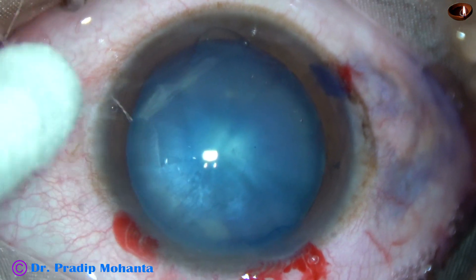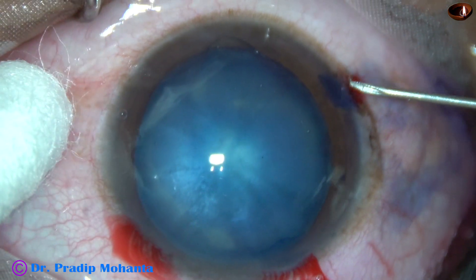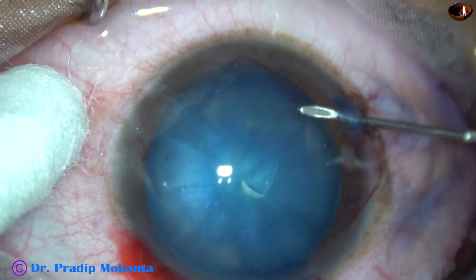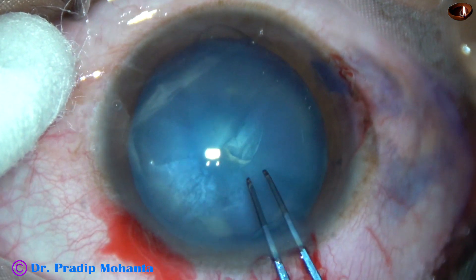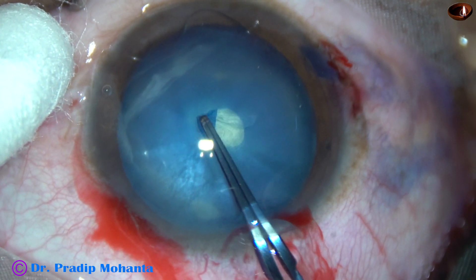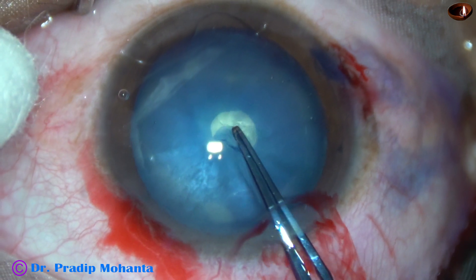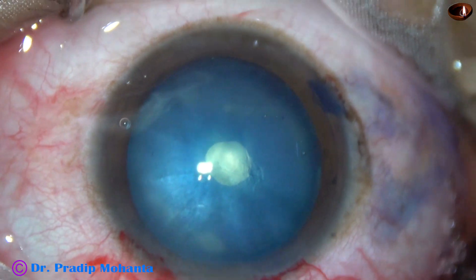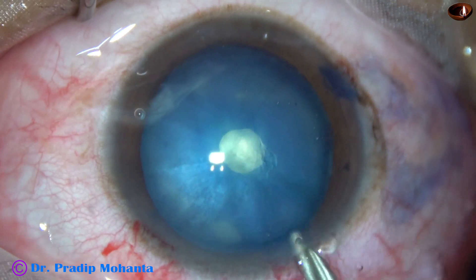And now my plan is to do a two-staged rhexis. This is a 26-gauge bent needle. A C-flap is raised in this way. And the C-flap is converted into a small rhexis. We can call this a mini-rhexis. The mini-rhexis has been very small in this case because the convexity of the anterior capsule was very high.